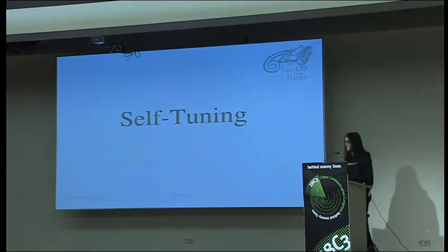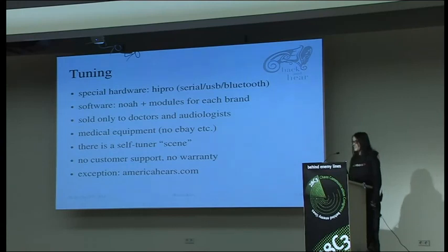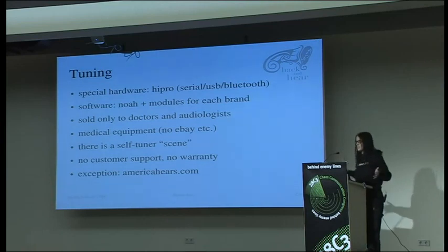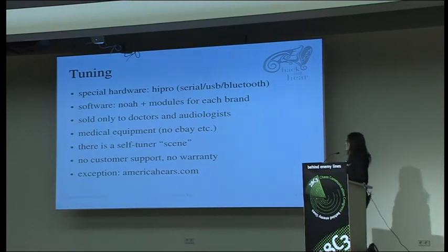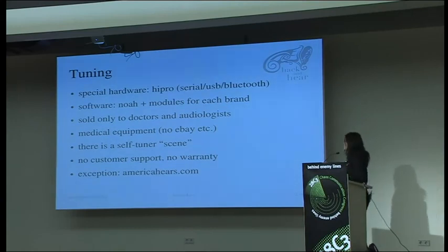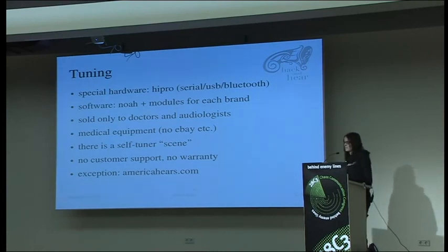The slightly bigger scene is the self-tuning scene for hearing aids, because as I said, it's kind of frustrating to get hearing aids. You have to go to the audiologist a lot of times and he asks you what's wrong, and then you have to describe the situation. But you're sitting in this silent cabin at the audiologist, so the adjustment is not really done in realistic circumstances. A lot of people get frustrated about that. They spend weeks tuning the hearing aids at the audiologist, and still they are not happy with it. So they try to get the hardware and software that is necessary for it. Those are only sold to doctors and acousticians or audiologists. They're not sold on eBay because it's medical equipment and this is not supposed to be sold on eBay.